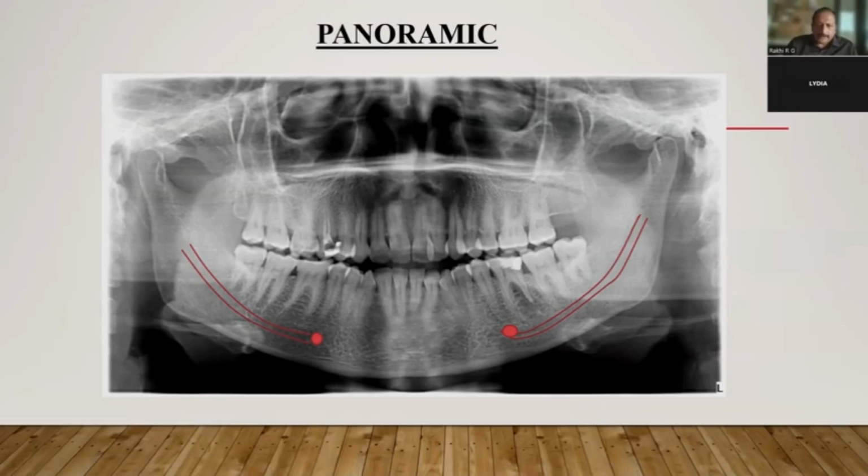The area which you have marked, the coronal area, the roof of the inferior canal seems to be closer to the radiolucency region, not to the root tip. To the radiolucency, it seems to be very close. So that's one thing that you have to be very careful about when you're placing an immediate implant in that socket, into the distal root of the first molar. If you happen to extract this tooth, considering all these factors, what are the other options?